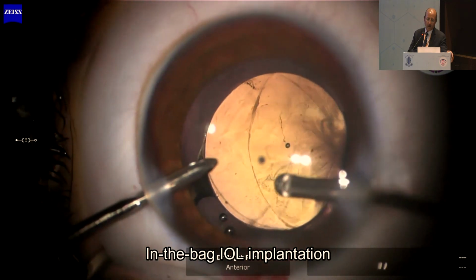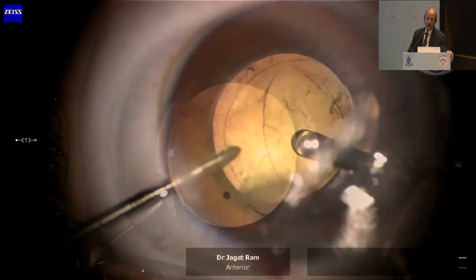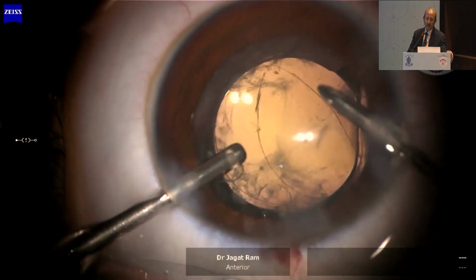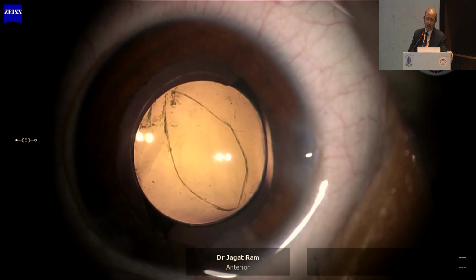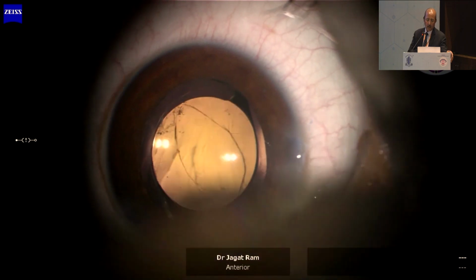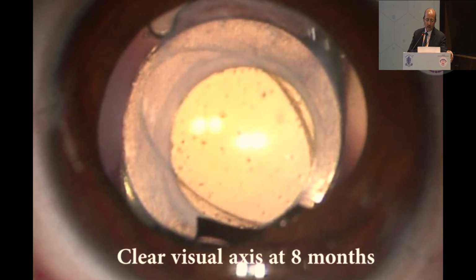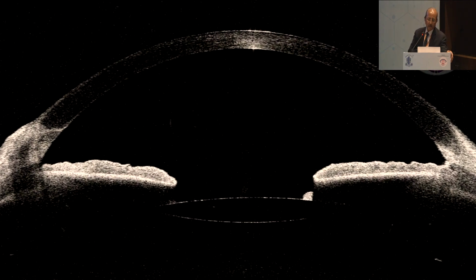And whatever vitreous is there at the site of the pre-existing rupture is cleaned, and surgery ended. And this is 8 months after, with a clear visual axis. This is anterior segment OCT.